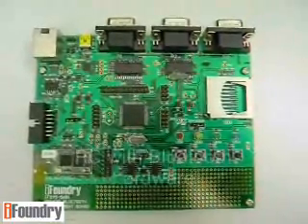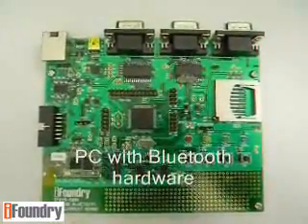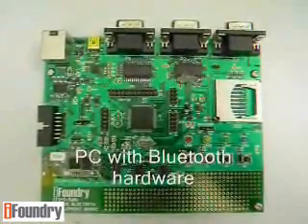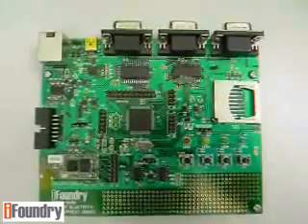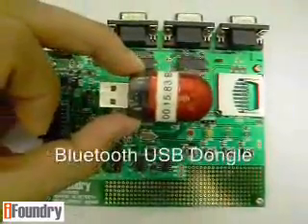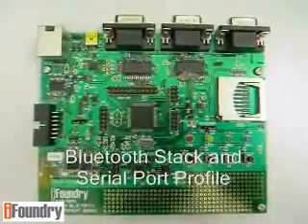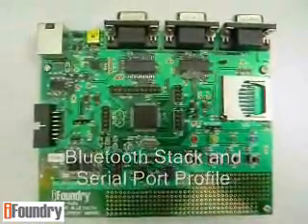Other equipment that you will need is PC Bluetooth hardware. For example, some newer laptops come with integrated Bluetooth radio, or you can use a Bluetooth USB dongle like this. This PC must also be installed with a Bluetooth software component, including a stack and serial port profile.